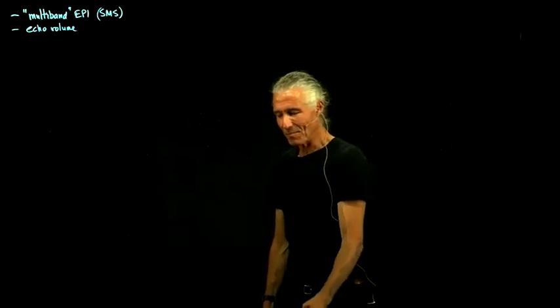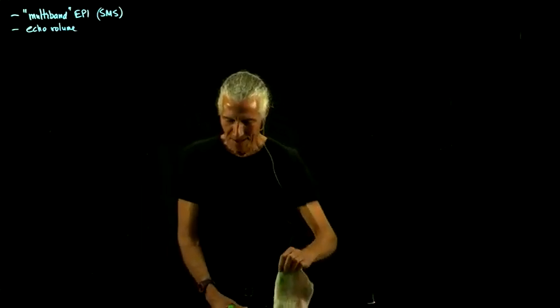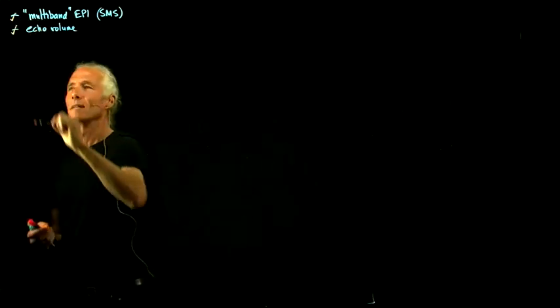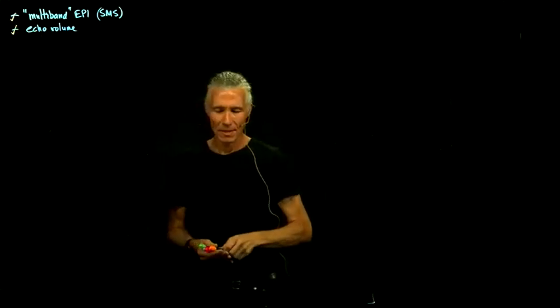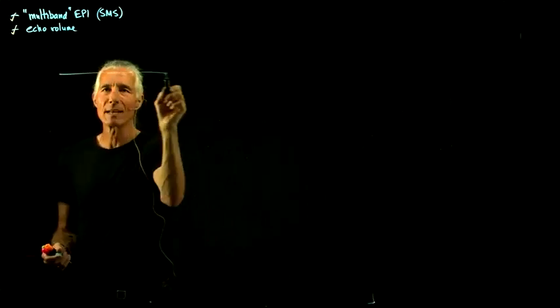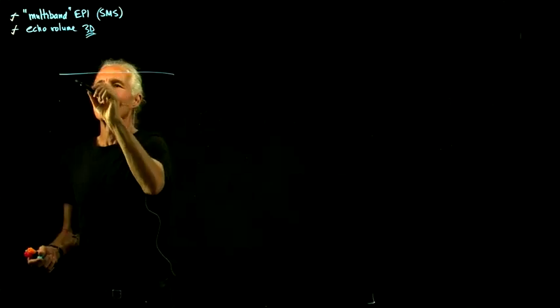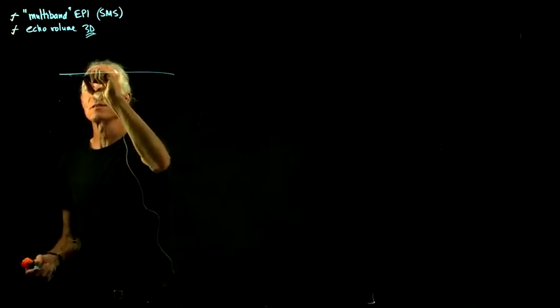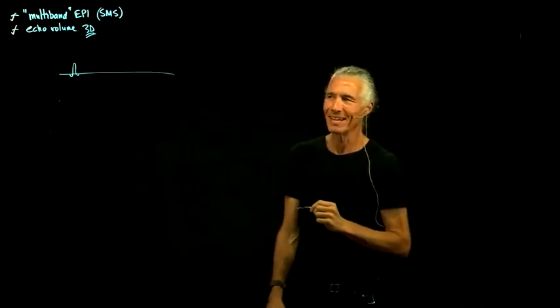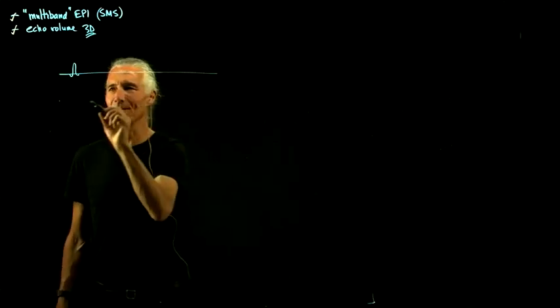Okay, so there's actually 1 minute left in class, but in the last 3 minutes, I'll go over echo volume imaging. So this one is pretty much like regular EPI, but 3D. And I always say, this is like fusion. It's the power source of the future, and it always will be. They've been working on it for about 60 years now, and it hasn't worked. It's probably not going to work.